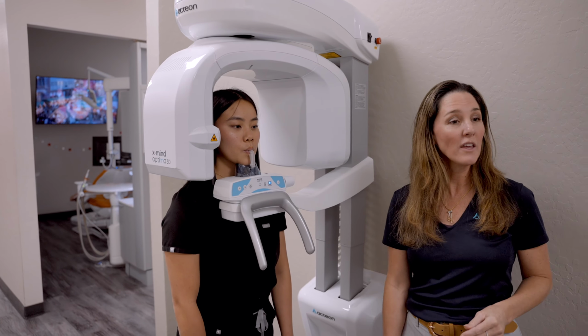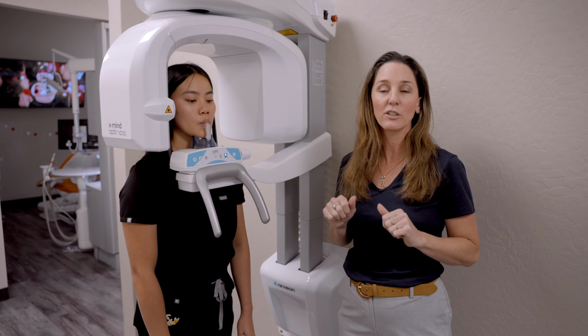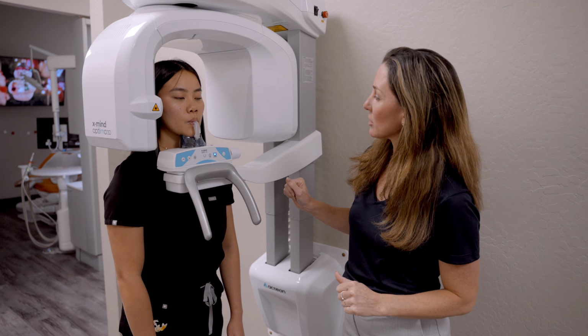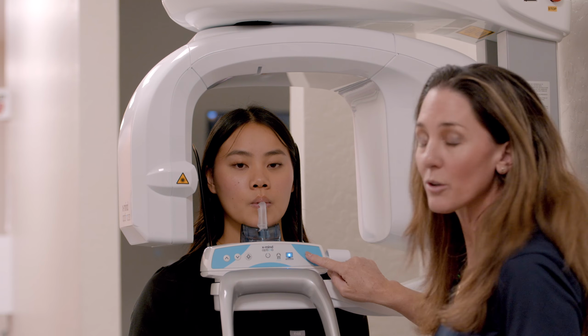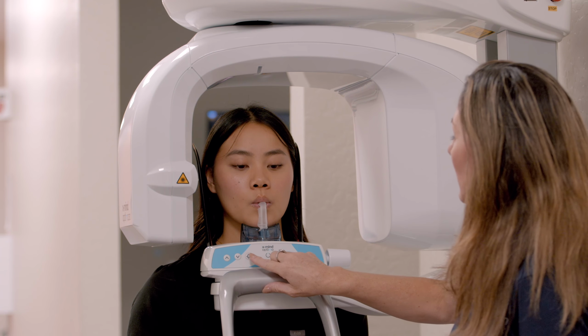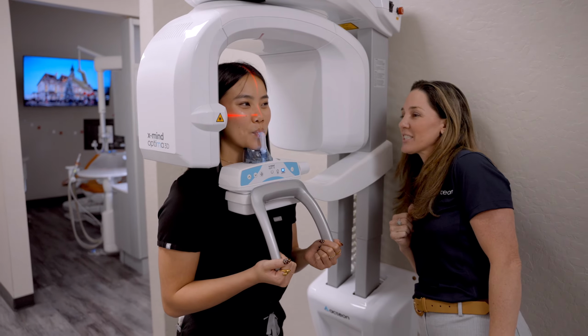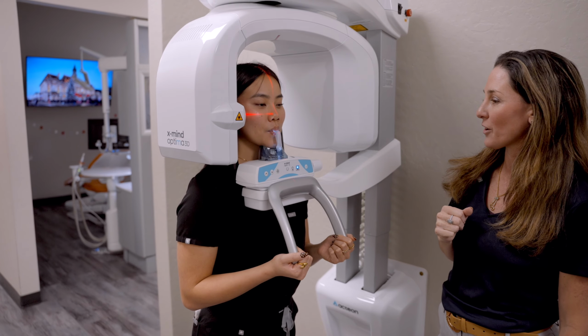Perfect. So on the panos, we have a slight tilt of the chin. On the cone beams, we want just flat occlusion. So right here, Vicky looks good. I'm gonna let the machine know that we are okay to take that extended field of view. And then I'm gonna make sure that the laser lights again are turned on. We're looking for just that mid-sagittal and that Frankfurt horizontal. And everything looks good. I can have Vicky smile just to verify. All right. Make sure that she's in those notches and she's not too far forward.